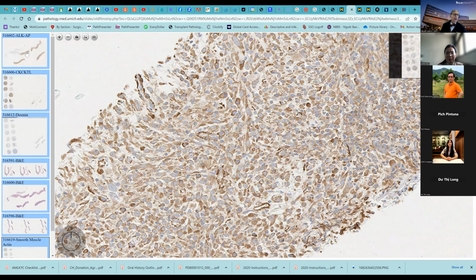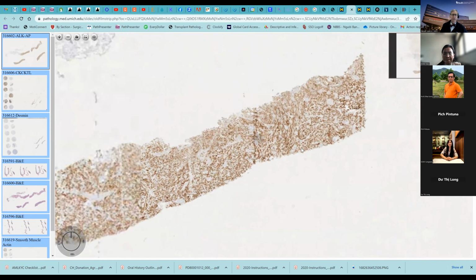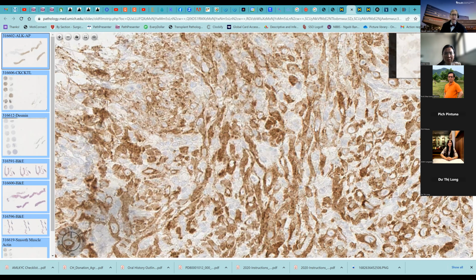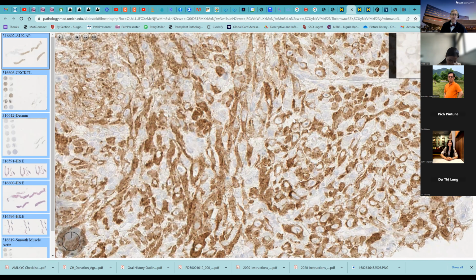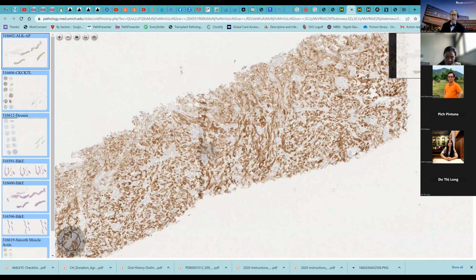And then this very nicely has an ALK stain to go with it, which shows you, again, the nice positive protein marker within the cytoplasm. This is not a nuclear stain, it's a protein stain, which shows nice positivity. But the presence of this is quite strongly predictive of the ALK rearrangement.